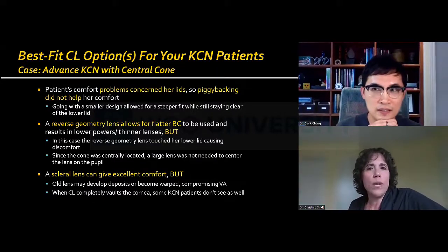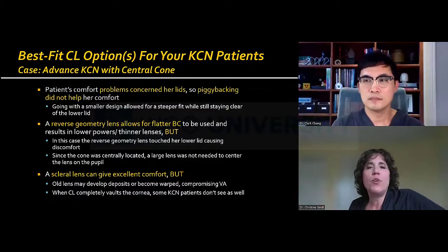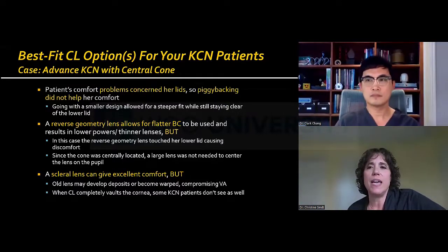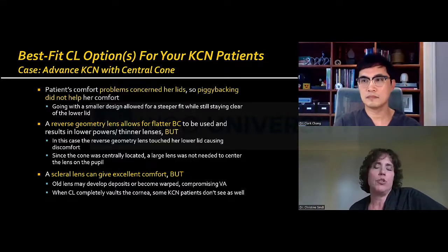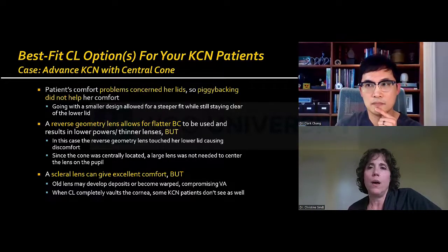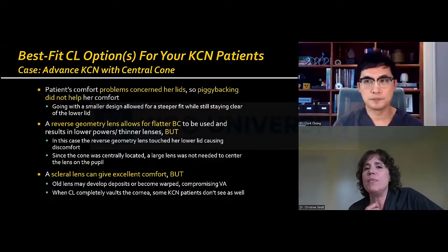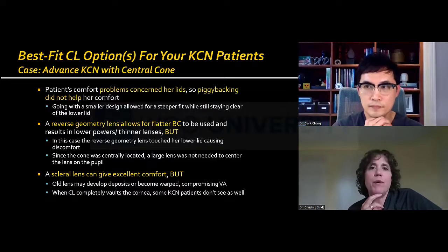No, there is always adaptation time for our patients. So I think that if you have a lens for the patient and they can see out of it, just having them try the lens for a while, there's really not much to lose to have the patients try to adapt to a lens situation. A lot of it comes down to listening to the words that the patient's saying, though. And I think maybe that's where some of my experience comes in.